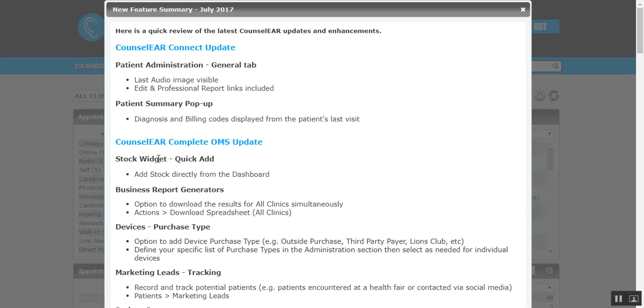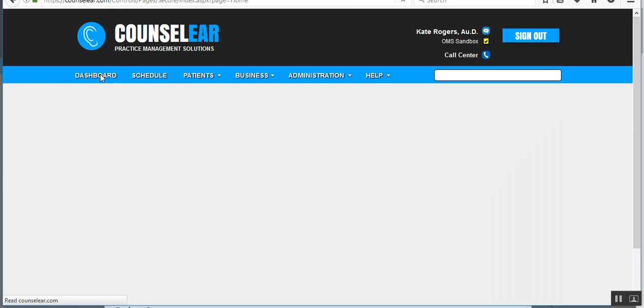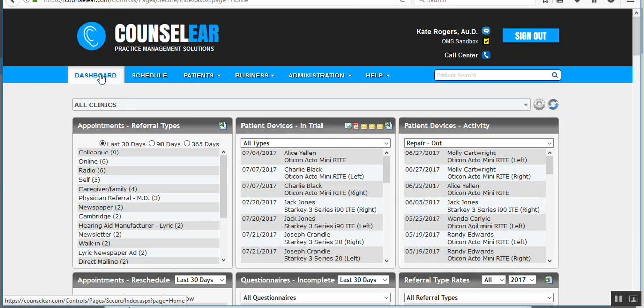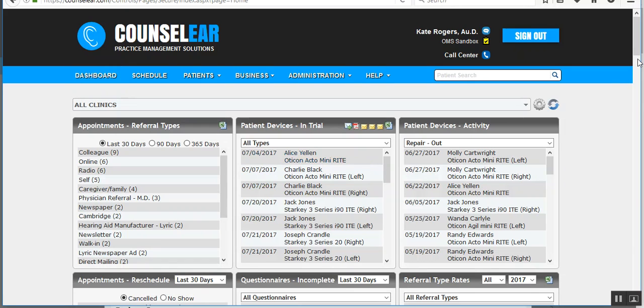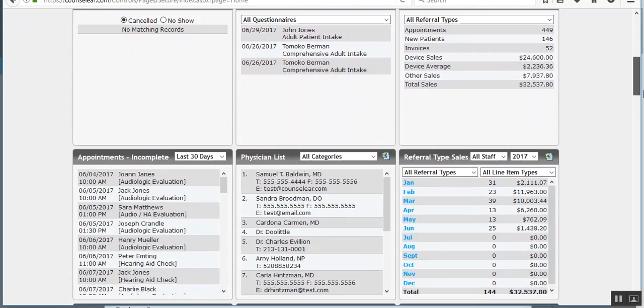Now, on the dashboard in the stock widget, there is the ability now for a quick add feature. As you likely know, in the past, you were required to go into the line item list and then add stock from there. But instead, we wanted to speed up that process.